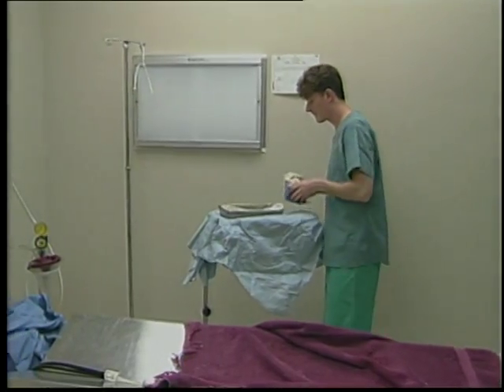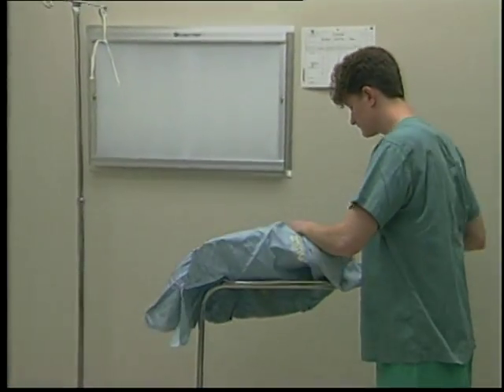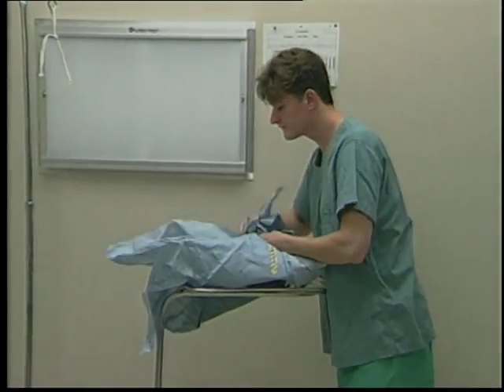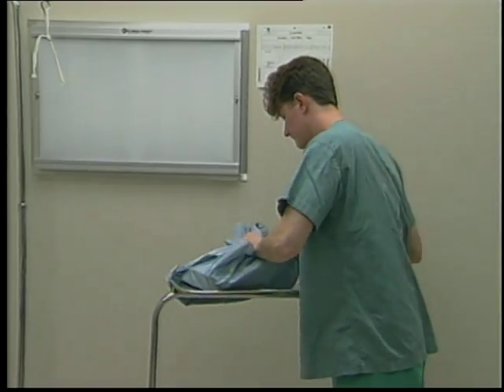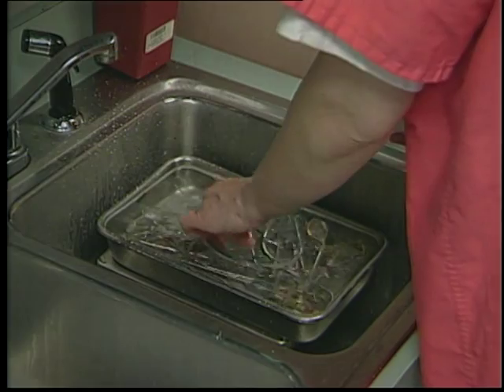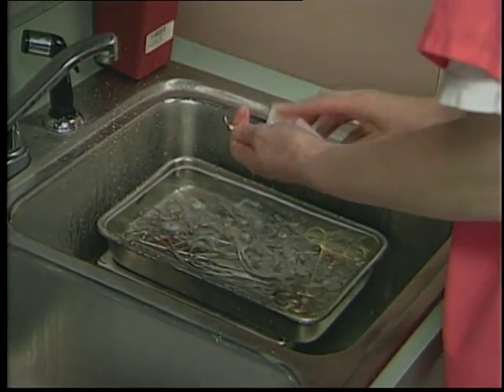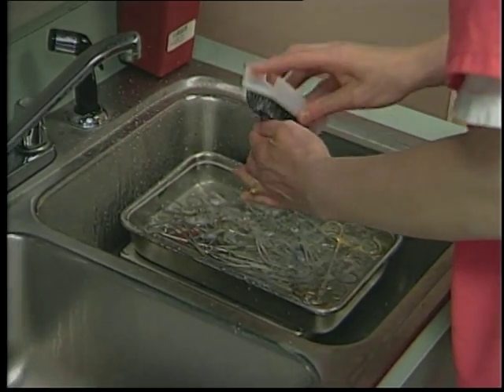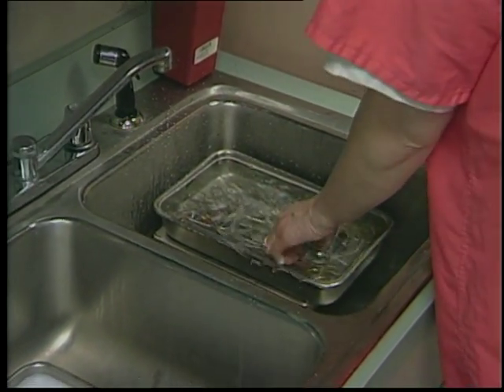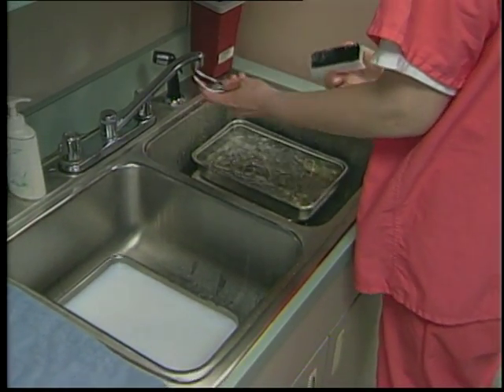Once the surgery is complete and the sterile field has been broken, it is time to begin the cleanup process. Caring for these expensive instruments is a very important component in ensuring that the instruments last many years. Before blood has had time to dry on the instruments, they can be soaked in cold water to loosen the blood. They will then need to be scrubbed with an instrument brush or toothbrush to be sure they are 100% free of obvious blood and tissue.